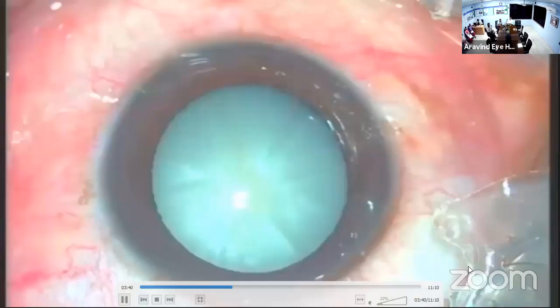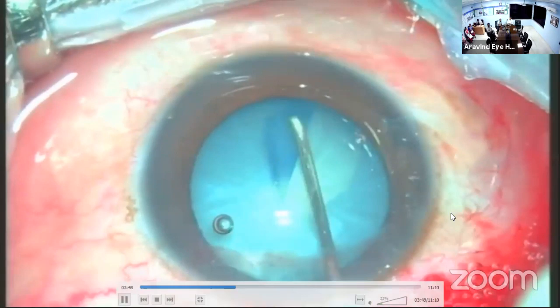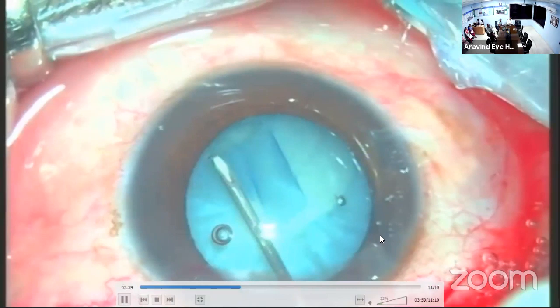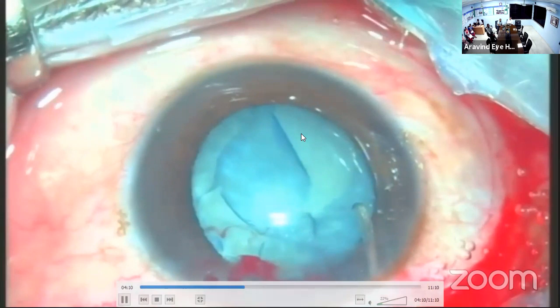We are used to making small rhexes. When you aim to do a large rhexis, the common problem you're going to face in an intumescent cataract like this is a runaway rhexis. When you have a runaway rhexis, what I would recommend is to complete your capsulotomy with a can opener technique. If you give radial cuts with the Vannas on the other side and complete your rhexis with the forceps, the problem you're going to have is one weak area. That is going to cause a lot of problems when you do hydrodissection.